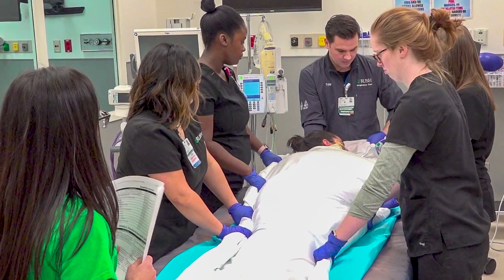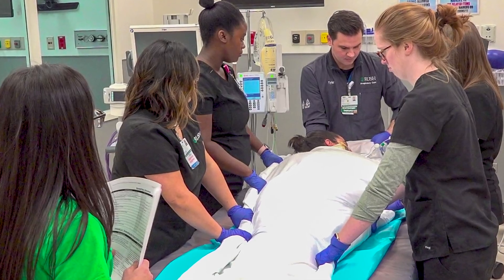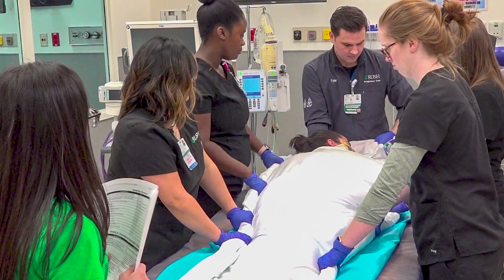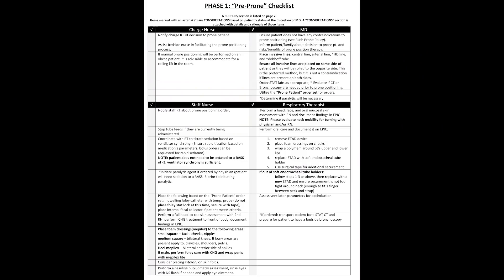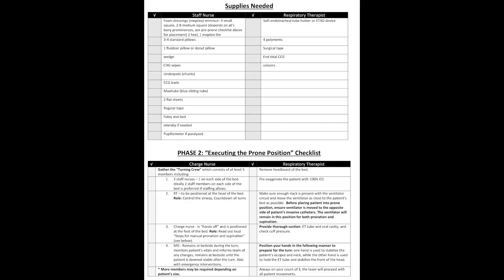We developed a four-phase checklist to facilitate the process of placing the patient in the prone position, which is shown in this video. Phase one checklist consists of getting the interdisciplinary team on board to prepare the patient to be placed in the prone position.